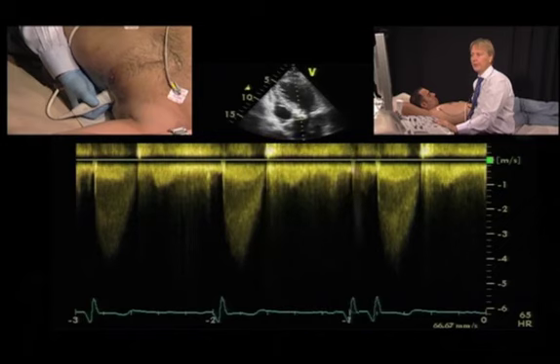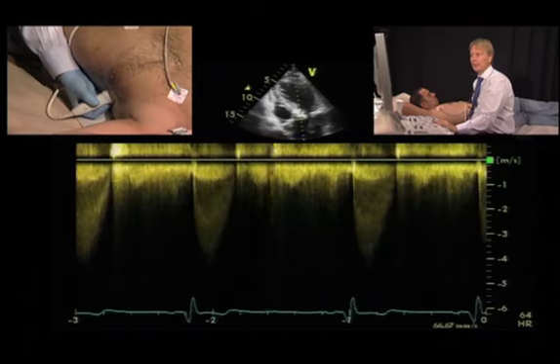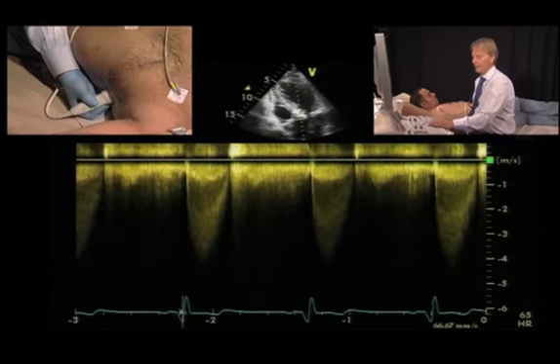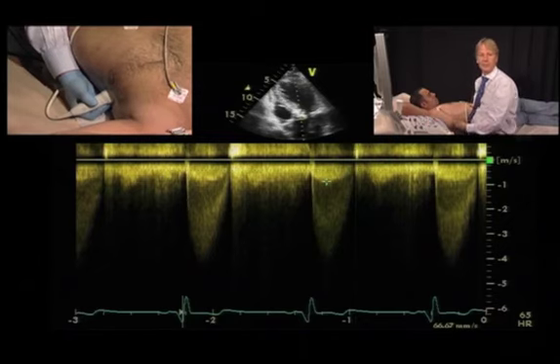So from this position I would then wait to see if I get a beat which is high, and then I could measure the gradients. Also very important to see that you get the LVOT within the curve. First of all, this gives you information if you really have the signal of the aortic valve, and second of all, it's usually a sign that you are in an optimal position with your Doppler spectrum. In the next demo, let's look at what we can actually do with the acquired tracing of the Doppler spectrum and what information that can give us for the quantification of the severity of aortic stenosis.